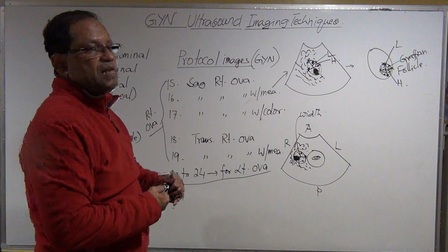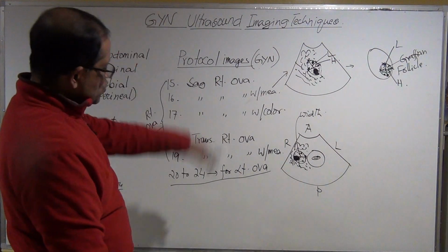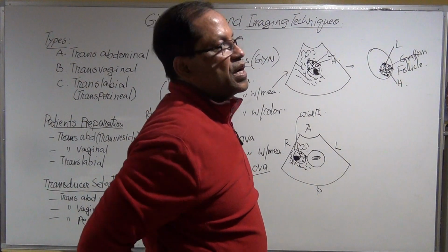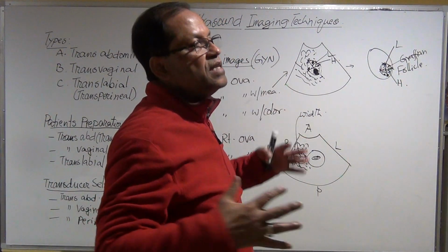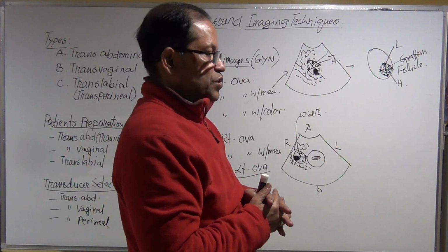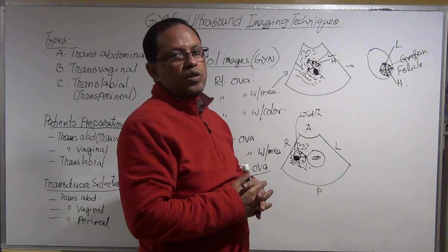Same style, same thing. These 24 images are universally recognized as the complete GYN protocol.